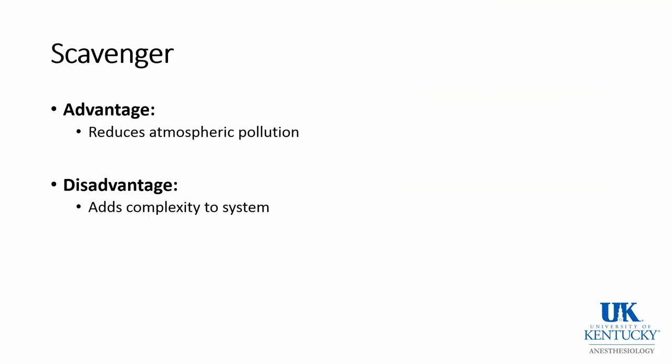Scavenger. At one time, anesthesia machines were not scavenged. However, things have changed, and all anesthesia machines have scavenging. Of course, being a mechanical device, it is designed to be used in a certain way, and it needs to be checked, and there's risks and benefits to it.